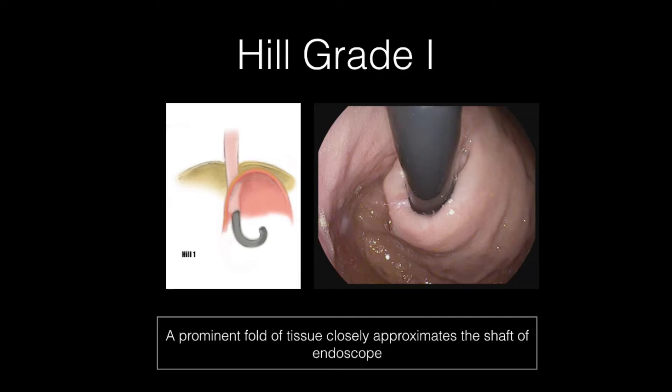A grade 1 valve is defined by the presence of a prominent fold of tissue closely approximated to the shaft of the endoscope and extending 3 to 4 centimeters along the lesser curve at the entrance of the esophagus into the stomach.